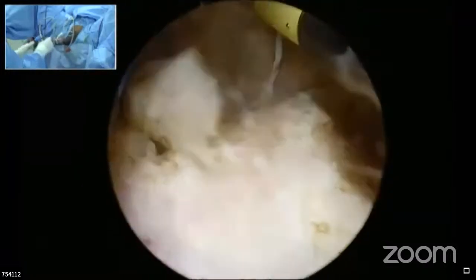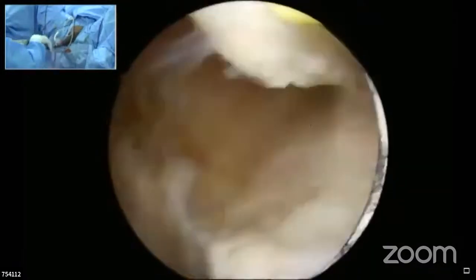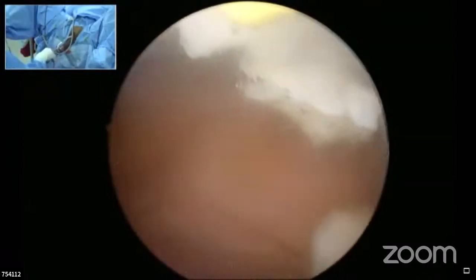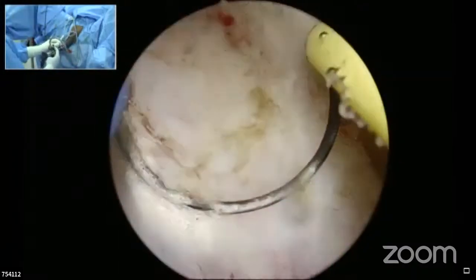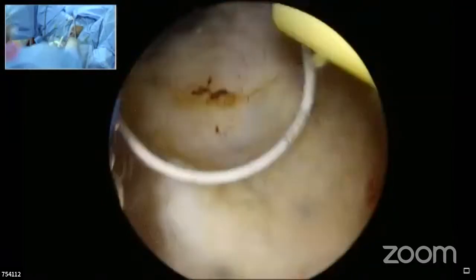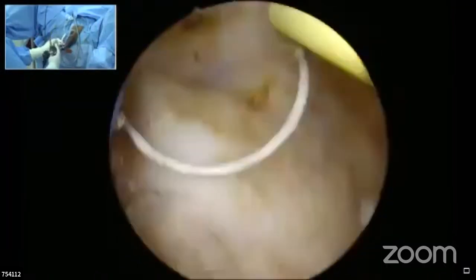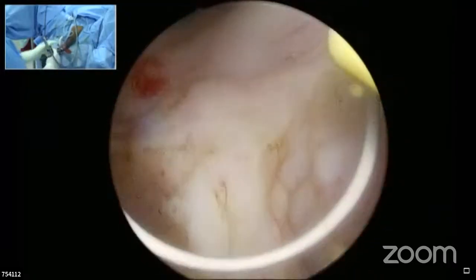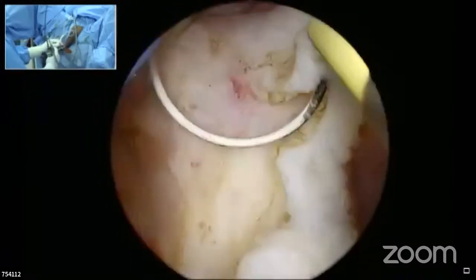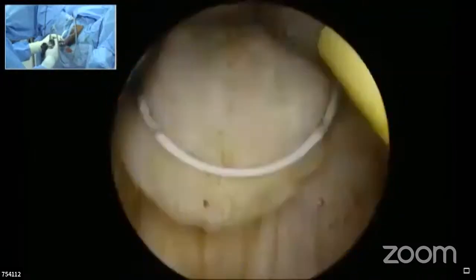Mali, have you used the Indian bipolars? I tried one once, an Allen, but I didn't like it. There's a question: which is the best Indian bipolar machine? I've used both Shalya and Allen. Both are good, but they are not comparable to Olympus. Have they done a study before launching it? No, they have not done a study, sir. It's only that they are not comparable to what Olympus or Storz gives. If you look at the monopolar cauteries earlier, the Covidien was very good. Covidien is good.